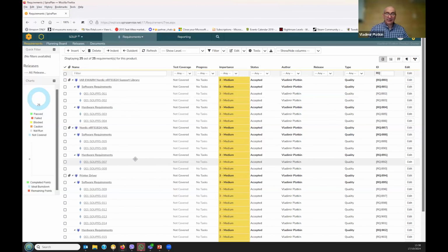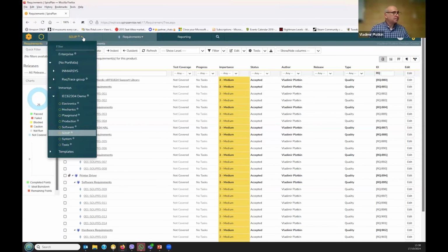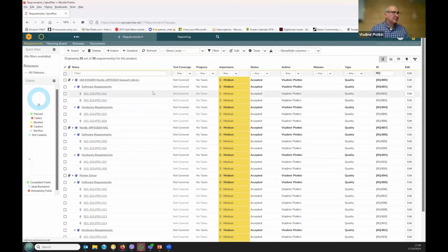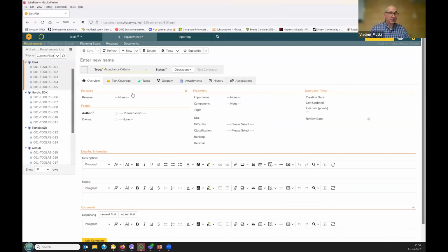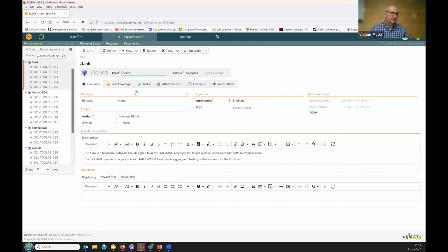They need to be tested. So the test team will create test cases, and it needs to be formally validated, and will go into the validation thing. The same thing goes with tools, exact same stuff. So we need to validate our tools. So we have, for example, JLink, our JTAG. Those who work with embedded software know what it is. So JTAG SWD access for sync.